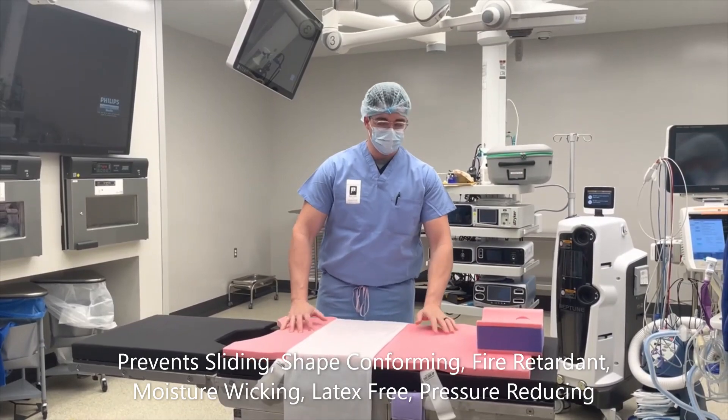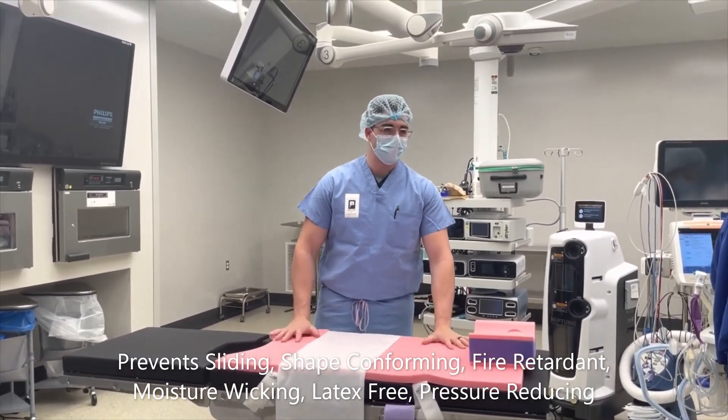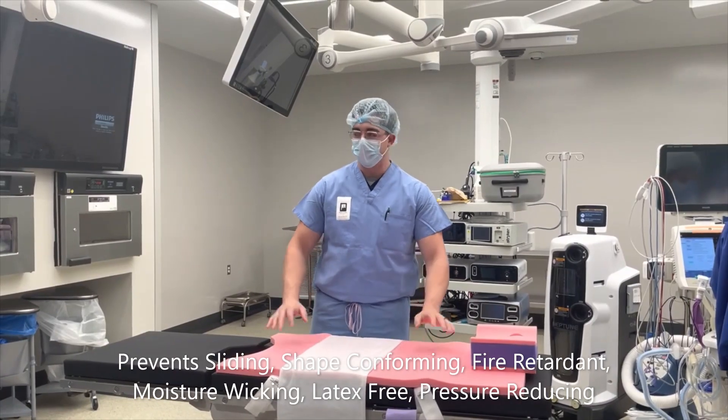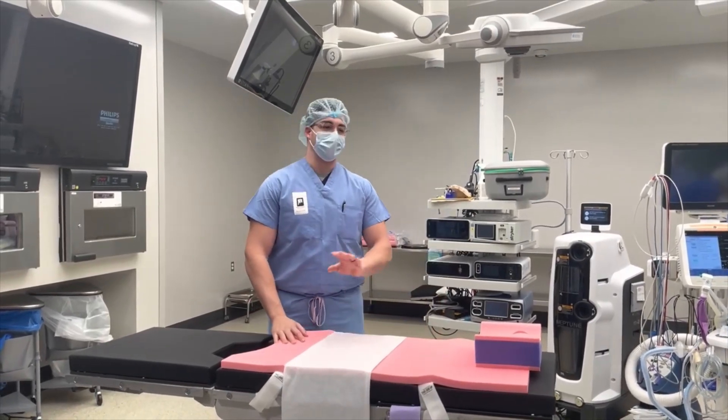Pink pad material in general is going to prevent sliding, pressure reducing, shape conforming, moisture wicking, breathable, latex free, fire retardant. It'll probably do your taxes too if you ask it — just kidding, just a bad morning joke I like to start with.